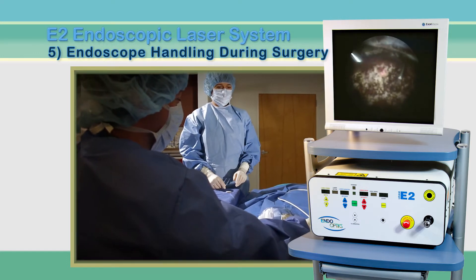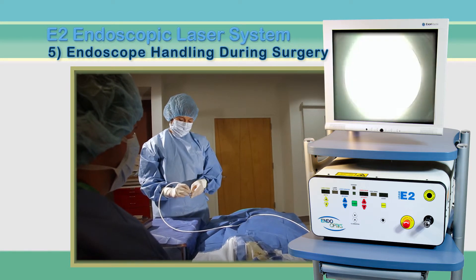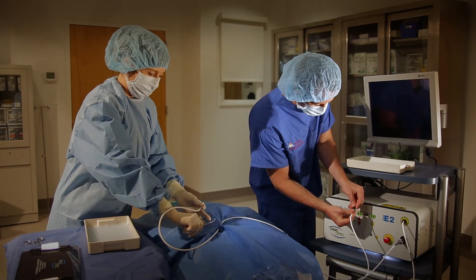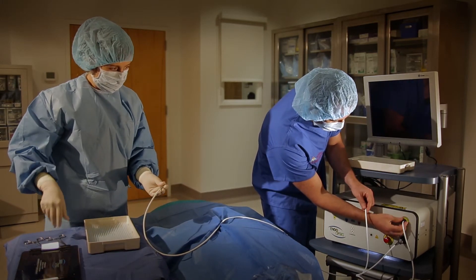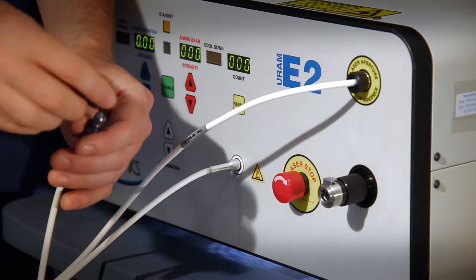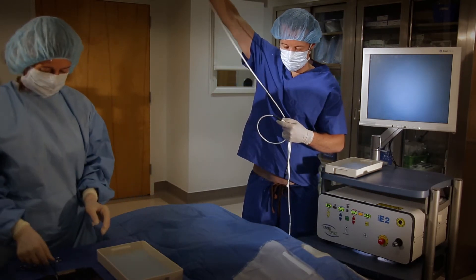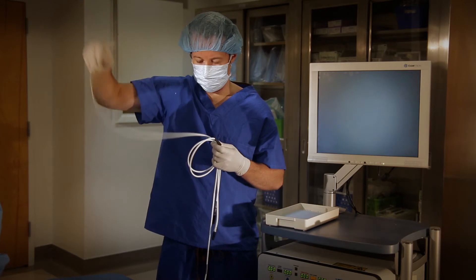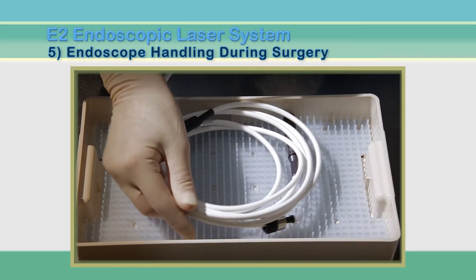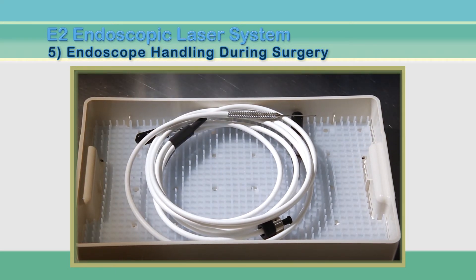When the surgeon is finished with the endoscope, the tip should be wiped again in the same way and the image inspected for clarity. The three connections to the unit are then disconnected, being careful to remove them by holding the connector ends and not by pulling on the white sheathing. Use the release lever to detach the video connector. Protect the ends by replacing all connector caps — extra caps are included with each endoscope. The circulating nurse then accepts the endoscope as it is passed from the sterile field. Take care to pack the endoscope correctly to avoid breakage of the optical fibers. Place the endoscope back in the tray, coiling it with the working tip at the top as shown, to eliminate tangles and allow for convenient removal on the next use.